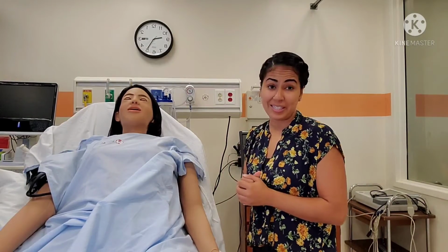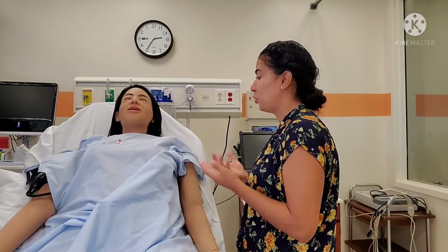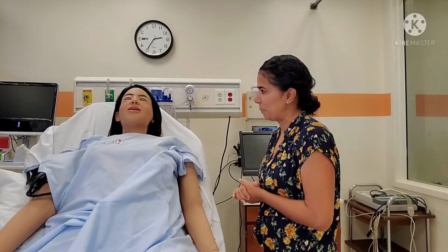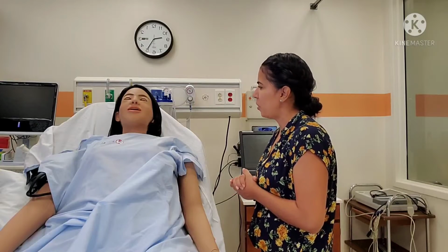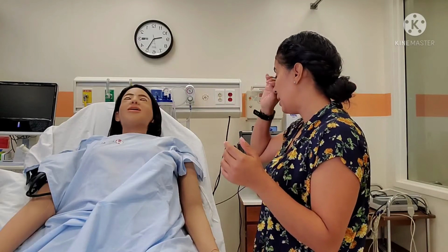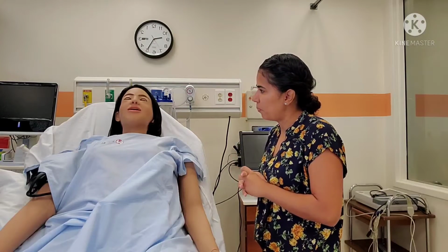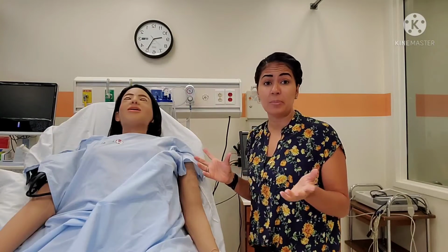How are you feeling today? I'm sure much better from the chest tube, right? Since the chest tube is inserted, I'm sure you're feeling much better. How's your pain level on a scale of 0 to 10, 10 being the worst pain you've ever felt? What's your pain level right now? A 2? Okay, 2 is reasonable.